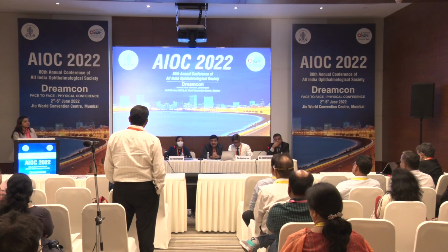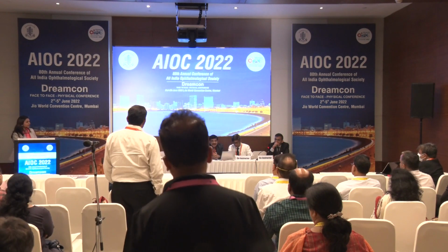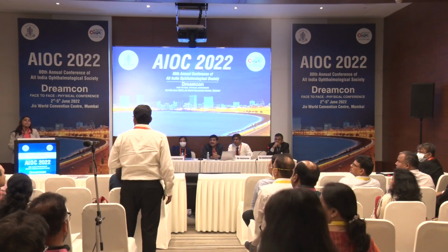So just do it in 15, 20 good eyes, myopic, or where you have good exposure, and find out what's your average deviation. So you don't need to do it for every eye, because that's too much of a stress, like Sir said. Right. Quality of the mobile picture are not so good.